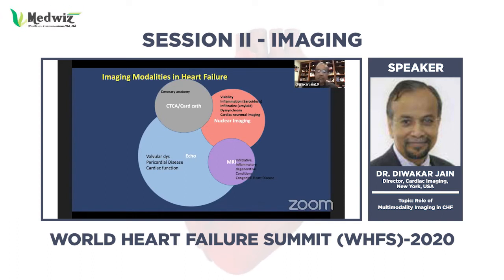Now, there are multiple speakers who are going to talk in detail about echocardiography, MR, CTCA, as well as some aspects of nuclear imaging. So I will focus on the areas where nuclear imaging can be helpful in patients with heart failure.